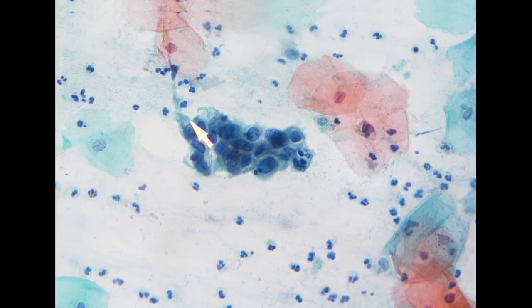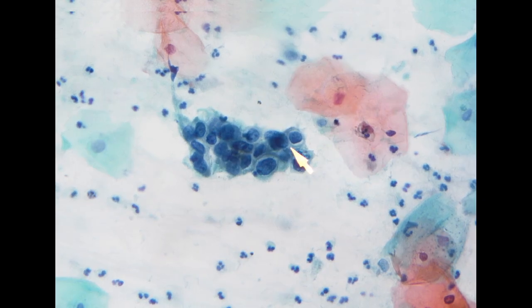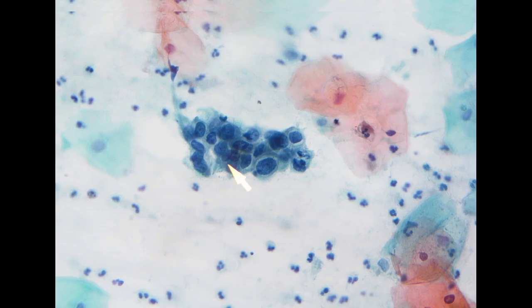These might be squamous because in the cytoplasm there are some processes, and there may be a very vague koilocytic change, but overall the cells are relatively polymorphic and hyperchromatic. So these look abnormal. If we want to look for other cells, we just go along this smearing direction. Again, on low power you see this is very dark. So you have a hyperchromatic crowded group here.